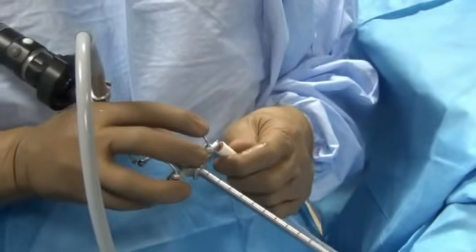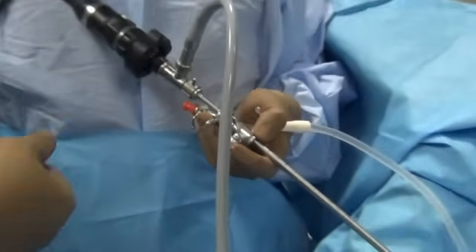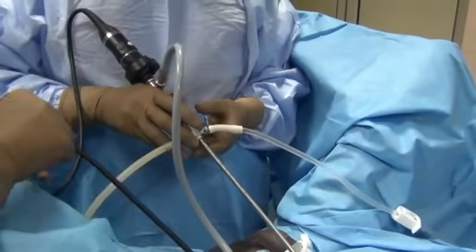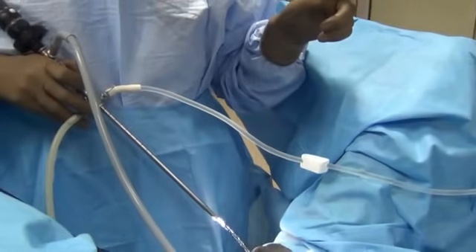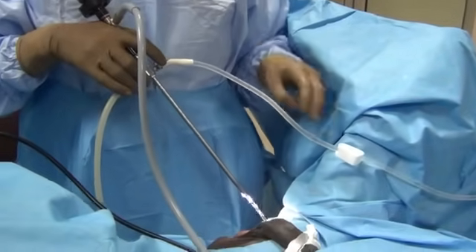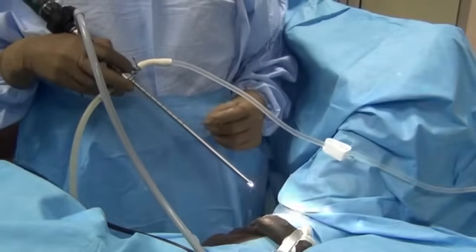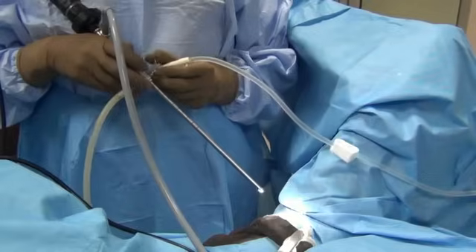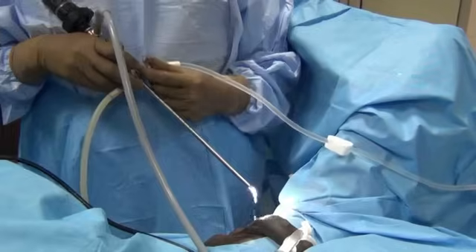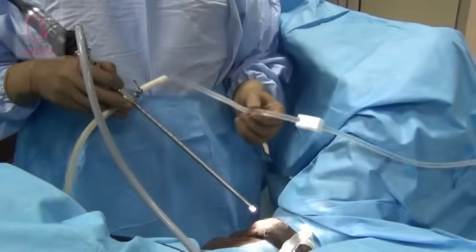Next, connect the irrigation lines. This is the inflow — water inflow — it is closed here and you will open it later. Then connect the outflow pipe here, and allow this tube to drop down into the funnel. Before inserting the cystoscope, it is very important to open the channel and let the irrigation fluid flow through. This serves two purposes: first, it flushes the cystoscope sheath of all chemical sterilizing liquid, as some residual chemical can remain even after washing. Second, it eliminates air bubbles from the lumen of the sheath so they do not enter the urinary passage. Flush the channel before introducing the scope.